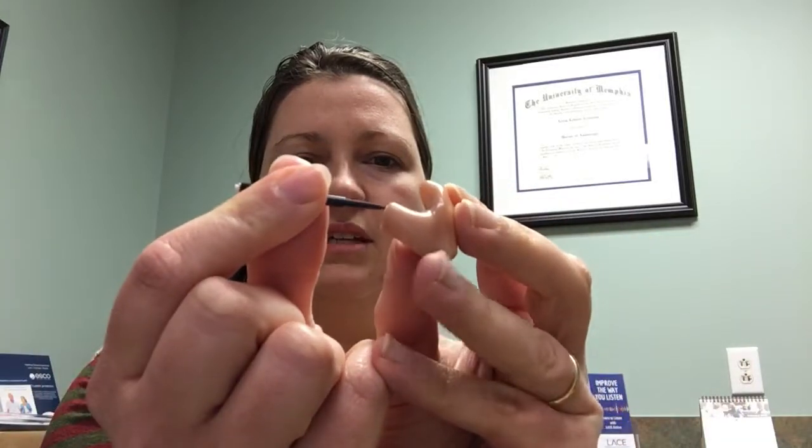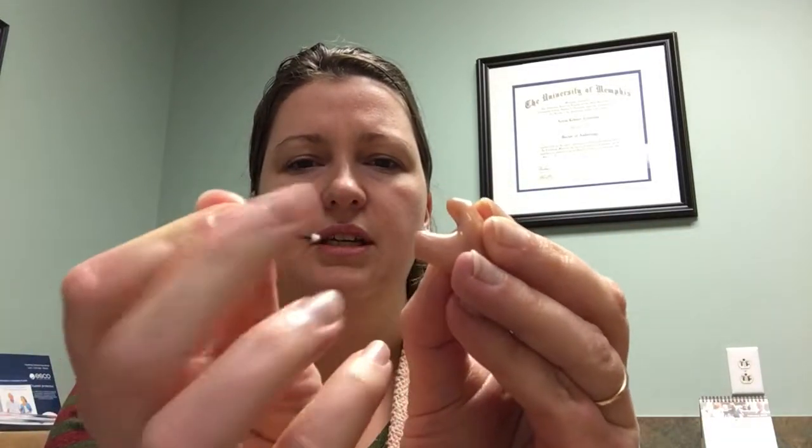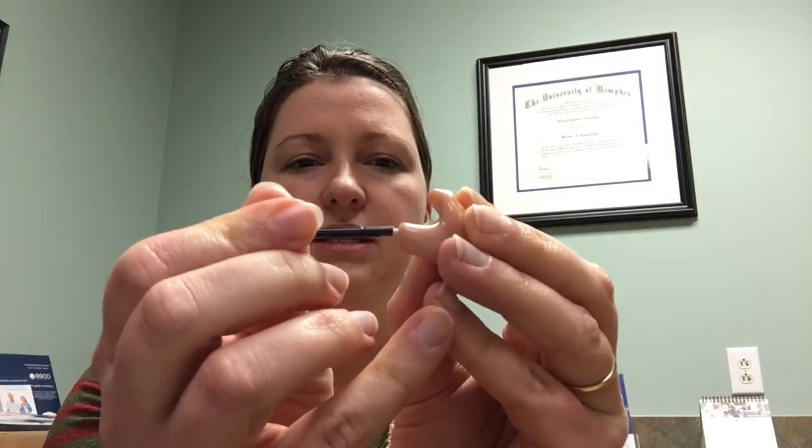These devices have a Cerustop wax guard on them, so I'm going to show you those. Different hearing aids have different types. You just need to make sure you're using the wax guard appropriate to your device. Using an incorrect wax guard can certainly cause more harm than good. These sticks pop out of the little packet and have a removal hook to take the dirty filter out of a hearing aid and a replacement filter on the other end. I'm going to show you with this hearing aid first. The little stick with the hook end goes straight in and straight out, and then you flip it around and just replace that piece straight in and straight out.